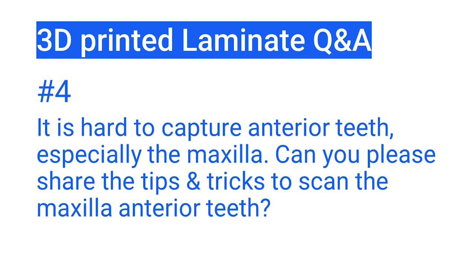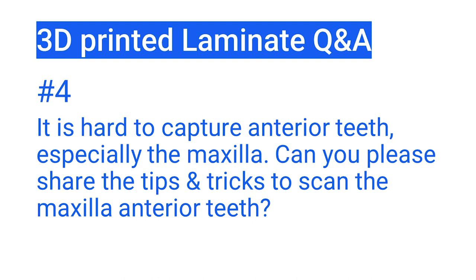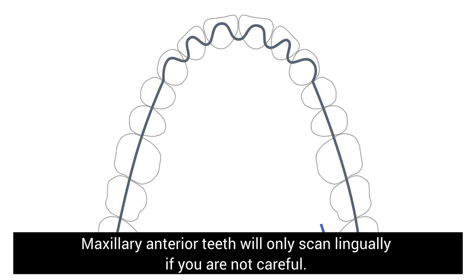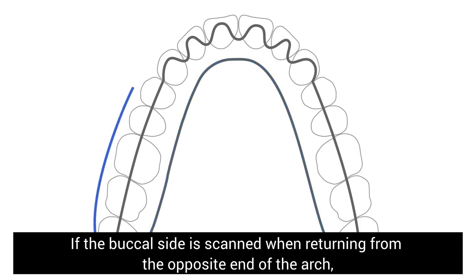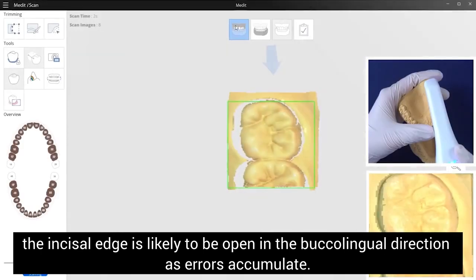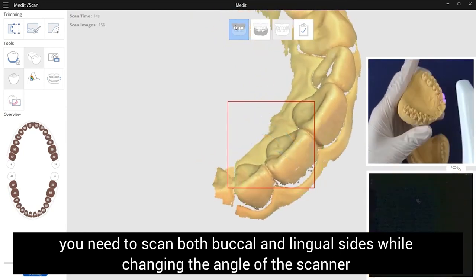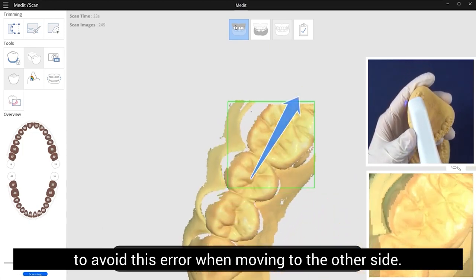Question 4: It is hard to capture anterior teeth, especially with the maxilla. Can you share tips and tricks to scan the maxilla anterior teeth? Maxillary anterior teeth will only scan lingually if you are not careful. If the buccal side is scanned when returning from the opposite end of the arch, the incisal edge is likely to be open in the buccal-lingual direction as errors accumulate. Therefore, in the anterior region you need to scan both the buccal and lingual sides while changing the angle of the scanner to avoid this error when moving to the other side.